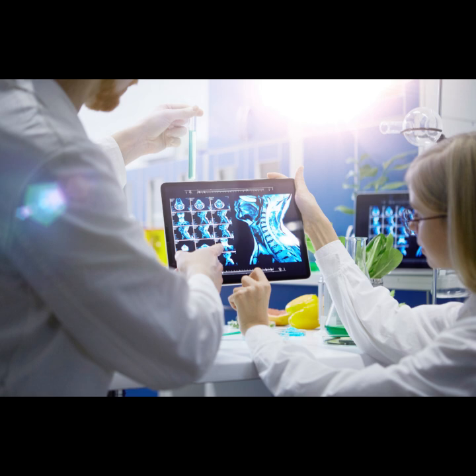Traditional way. Like standard Fourier transform imaging, often called spin warp, you do one RF excitation, apply a specific phase encode gradient, say for k-y line number 1, frequency encode, and read out the k-x data for that line, wait a bit, then repeat with a different phase encoding gradient for k-y line number 2 and so on. You need as many shots or excitations as you have lines in the k-y direction. Which could be 128, 256, 512 shots. Takes time. Seconds to minutes.